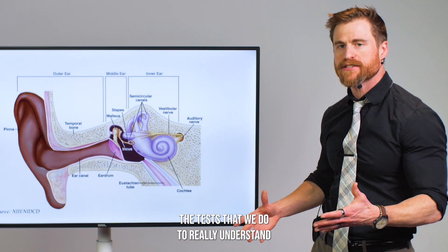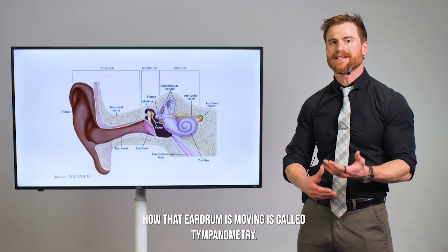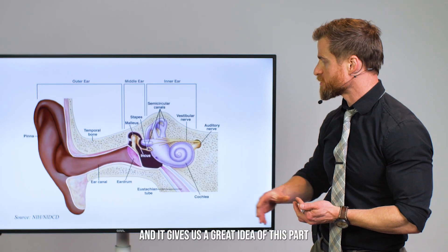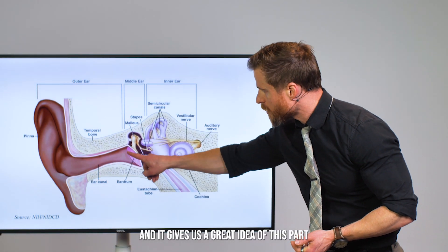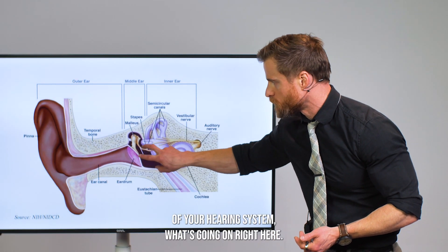The test that we do to really understand how that eardrum is moving is called tympanometry, and it gives us a great idea of this part of your hearing system. What's going on right here?